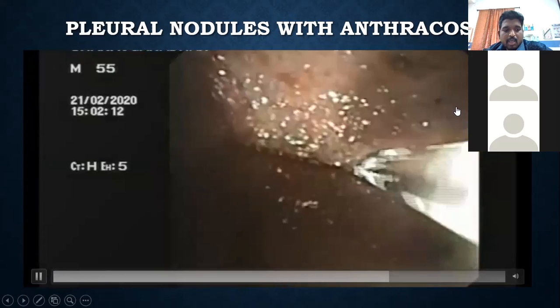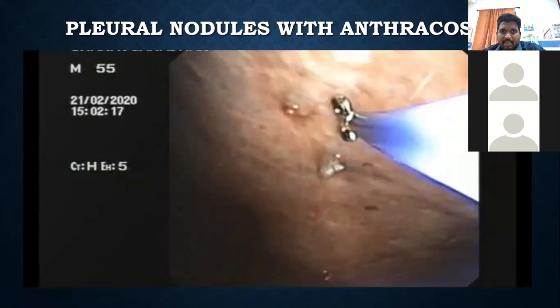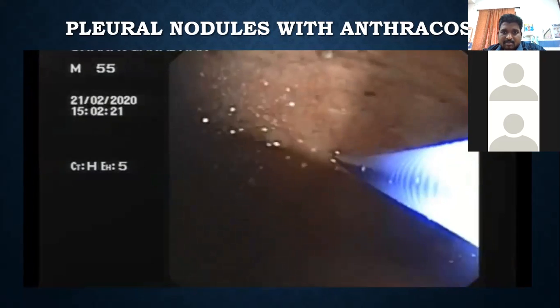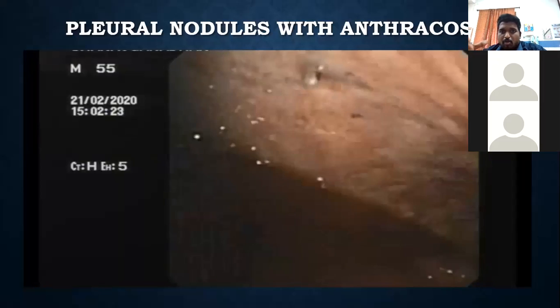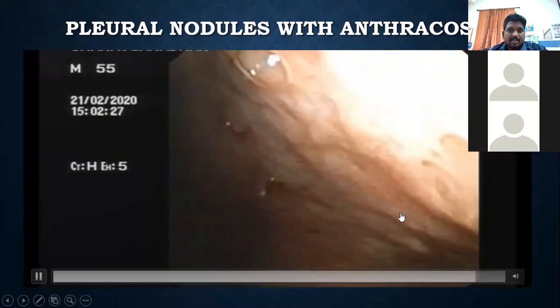It is anthracosis. If you see a black effusion along with the dense black pigment, you could see this also having a black tinge. Okay, like a mole, like a papilloma, all these things. So this is once again a case of metastatic adenocarcinoma.